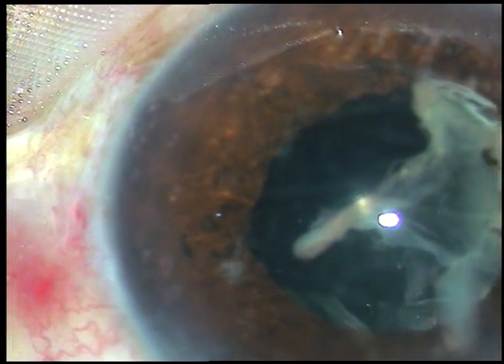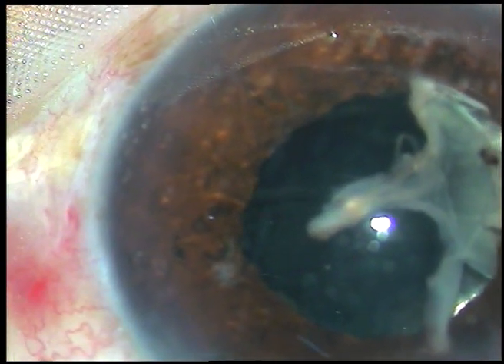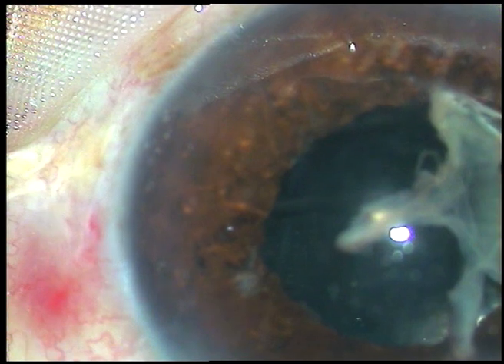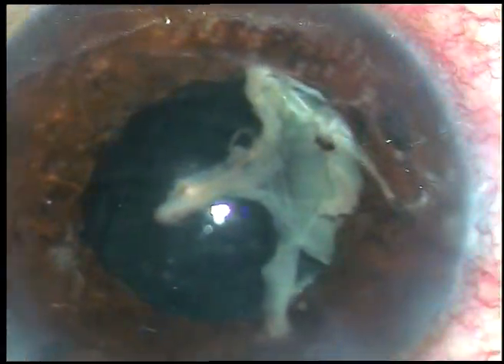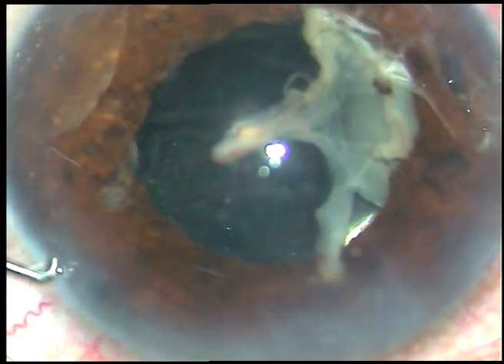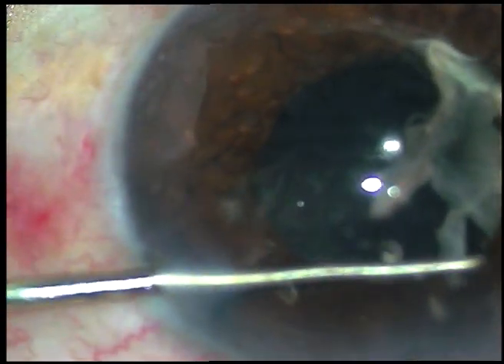I inject viscoelastic again and with the viscoe cannula itself I try to pull the membrane. But I see that just in front of the main incision, there is a thick band attached to the iris — just like it was at 2 o'clock. So I have to cut it, but I must pull it first, otherwise I will not be able to cut it at the iris. Yes — it has been cut.